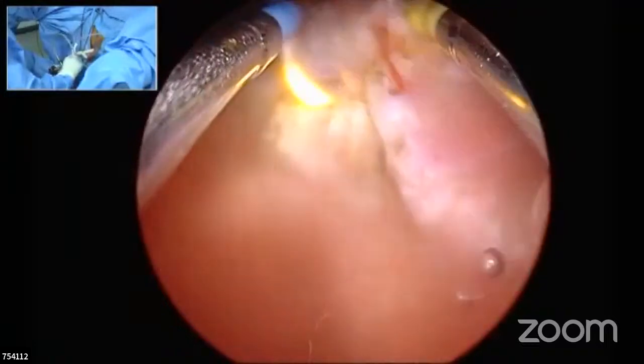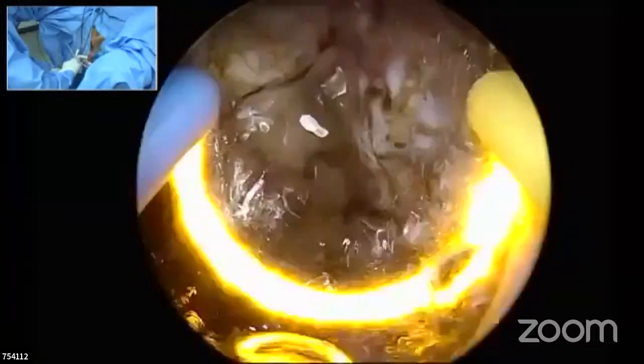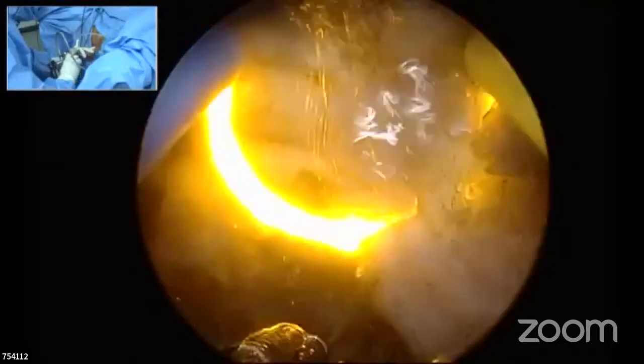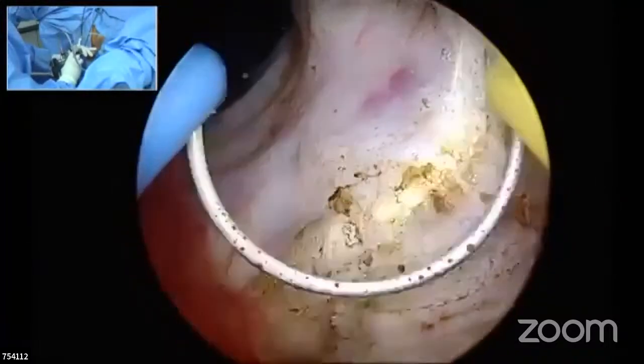Maximum 1 meter, some people used to give. But of late, being saline, the height really doesn't matter. Sometimes if the bleeders are a little high, we keep a little higher height so that the vision is better and the flow is better. That's all. I don't think we give much relevance to that at present.